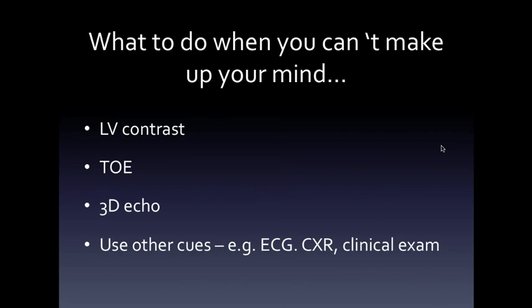In other words, there's a lot of stuff that goes on in the machine that, unless you're really familiar with the basic fundamentals of ultrasound, which most of us aren't, quite frankly I'm not, you can actually get the wrong information because you make the wrong set of assumptions. So TOE, for those of you who use intraoperative TOE in the cardiac theatre, you're masters at it. But TOE, just for your first time on a Friday night at 10 o'clock, may not be the best time to start using the modality.